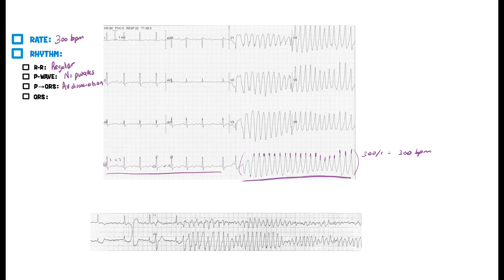From here to here is almost one whole box — about five little boxes — which is more than three little boxes, which equals 0.12 seconds. So this is wide complex tachycardia. Remember: high heart rate, regular rhythm, and wide QRS complex — you want to think about V-tach.